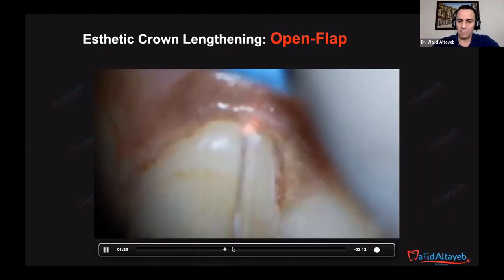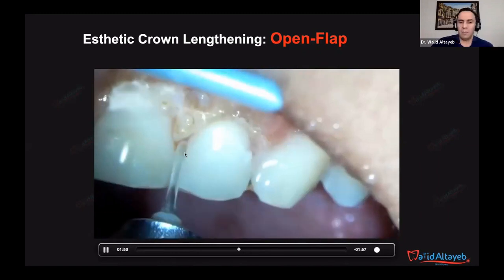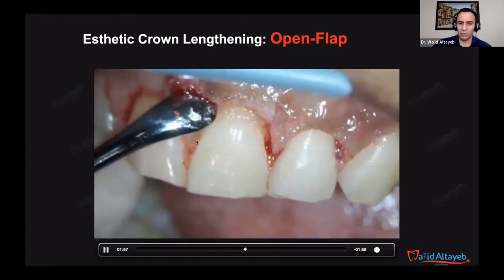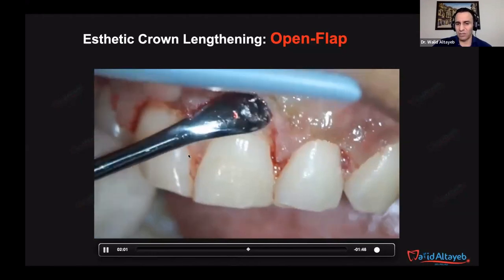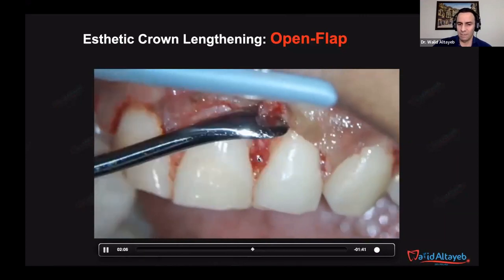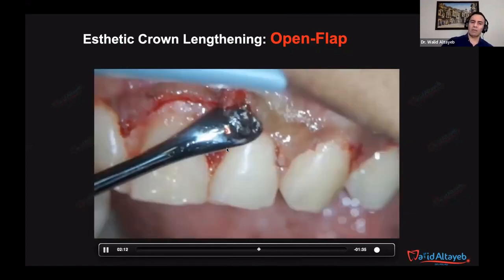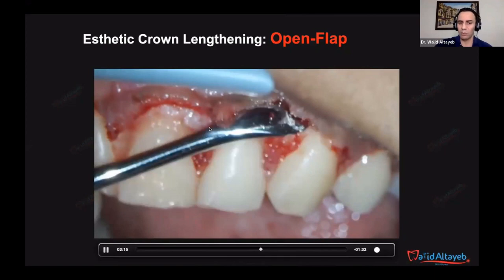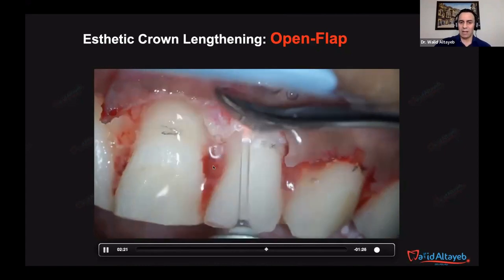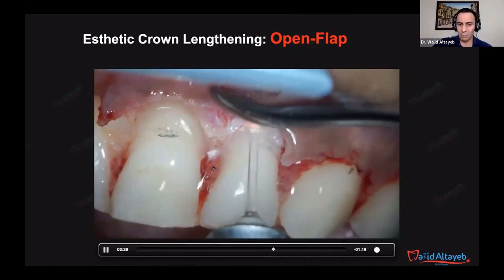With the flap, the good thing about using the erbium chromium laser is that it is a very predictable procedure to make a split thickness flap in the interdental area, which is sometimes delicate and challenging when you are using the blade. Here, in aesthetic crown lengthening, we are dealing only with buccal bone, with no need to deal with the interdental bone. So no need to raise the papilla. This papilla will serve later to receive the suture and for the stability of the margin.